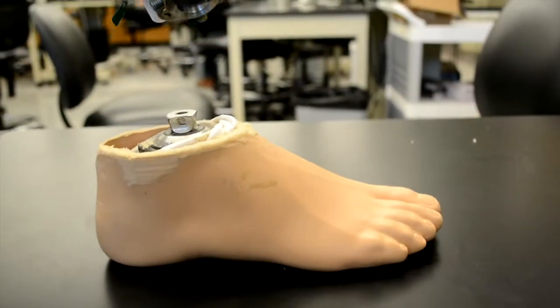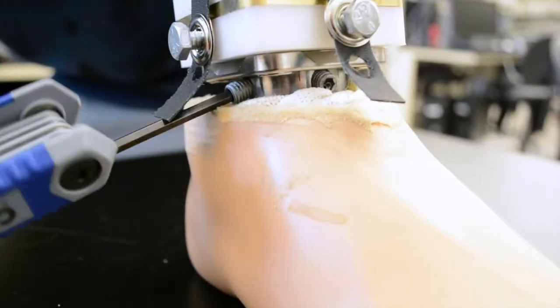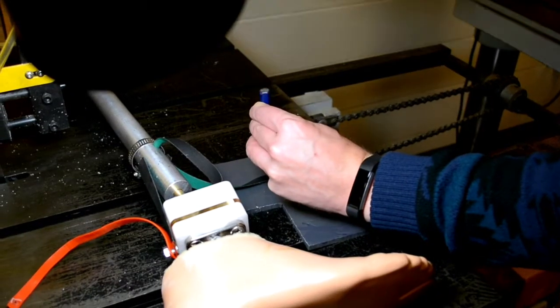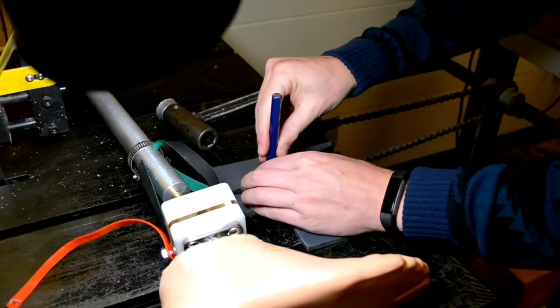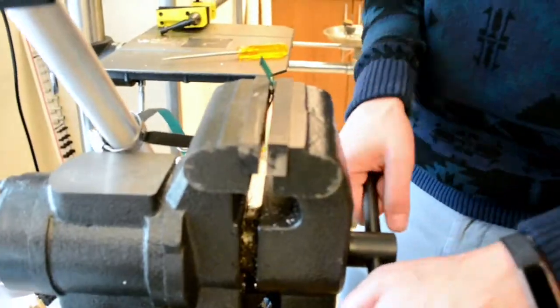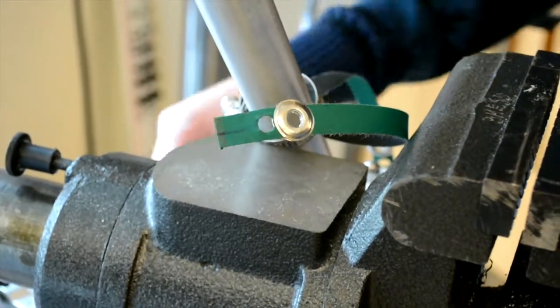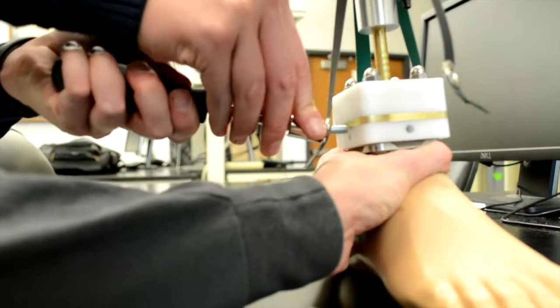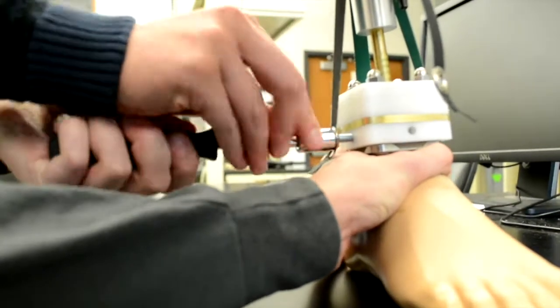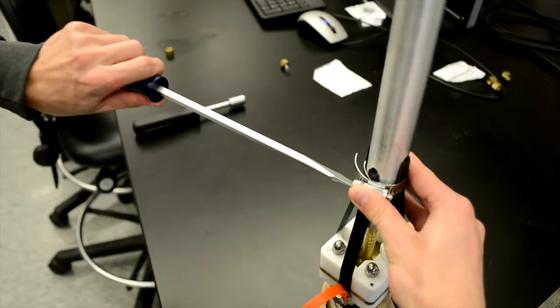The universal ankle foot interface allows the patient to attach any prosthetic foot they have to the MAP ankle. The unique tension system allows the ankle to return to equilibrium position after weight is removed. The entire system is made with high strength, light weight, and corrosion resistant materials, including Delrin, brass, and aluminum.